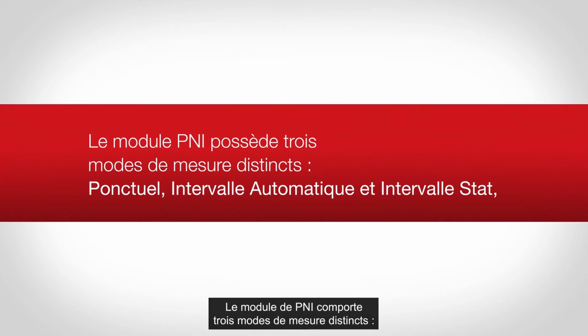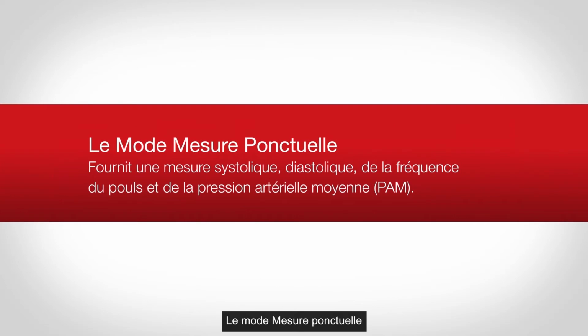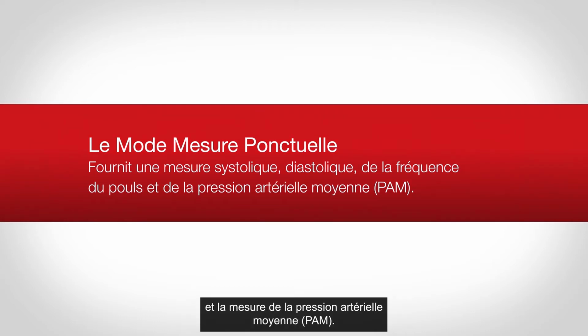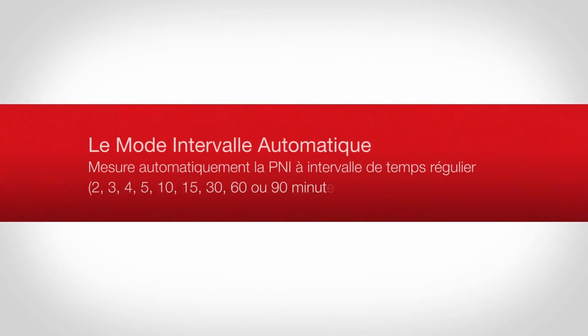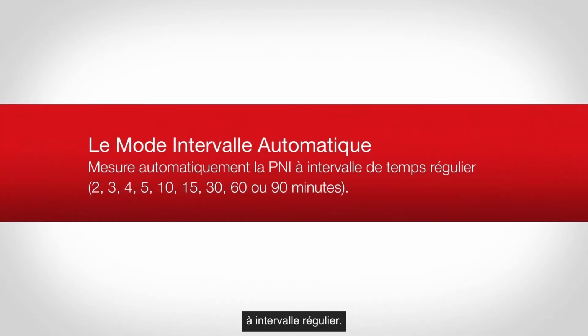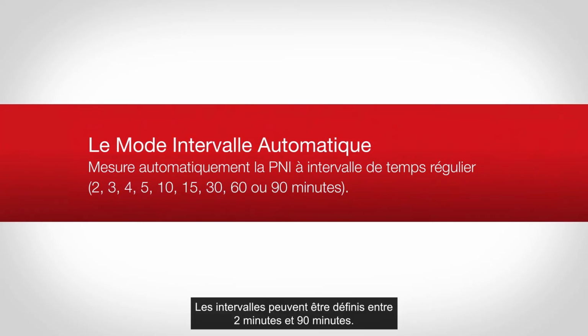The non-invasive blood pressure module has 3 distinct measurement modes: spot check, automatic interval, and stat interval. Spot check mode provides a one-time systolic, diastolic, pulse rate, and mean arterial pressure (MAP) measurement. Automatic interval mode will take blood pressure measurements once every desired interval. Intervals can be set between 2 minutes and 90 minutes.